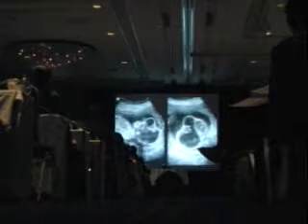Because amniotic bands is an injury. It's not something that's going to happen embryologically necessarily. It's a direct injury to the fetus, so it doesn't have to follow the usual rules. And here is an arm and an absent radial ray with a sort of partly amputated hand, also part of amniotic band syndrome in the same fetus.